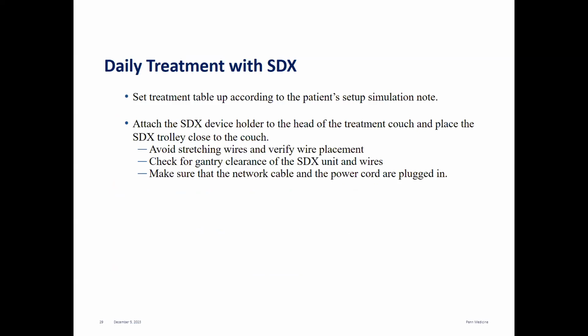So the daily treatment with SDX, you of course want to first set up the treatment table. We use setup simulation notes in our documents, and like Alaina said, this includes all of the devices used at the time of sim, pictures of the devices, where they were indexed and put on the table, the SDX level, and the time that the patient could hold their breath for. It's very important to add all that into that.